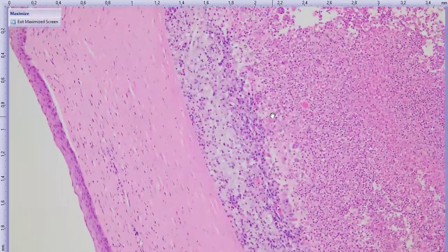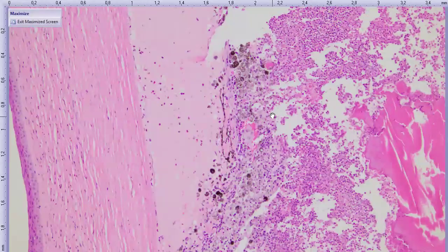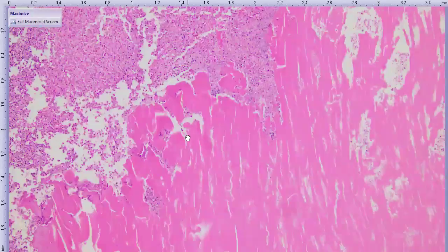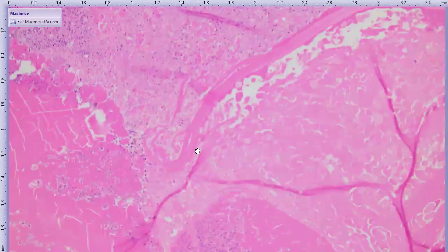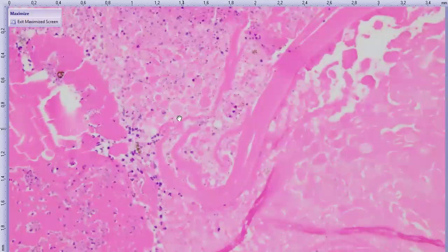And then if we fall back into what would be our anterior chamber, we can see a little bit of iris tissue here, and we can start to see our irregular portions of lens fibers. Here we go. So here is our lens capsule, our thickened portion of the lens capsule. This is the anterior side of the lens, and we can see that it is discontinuous.